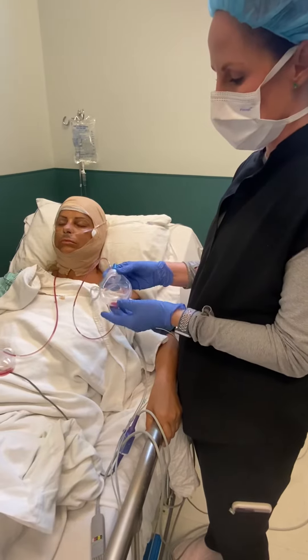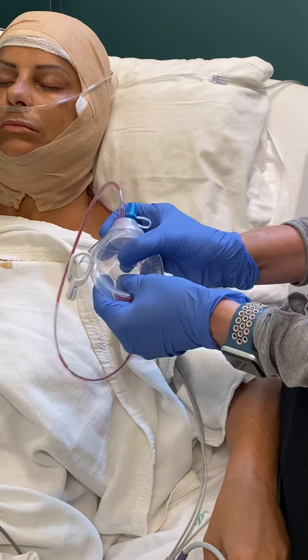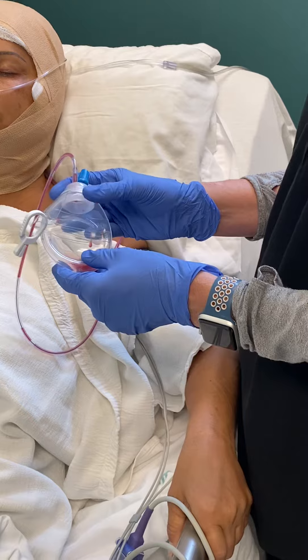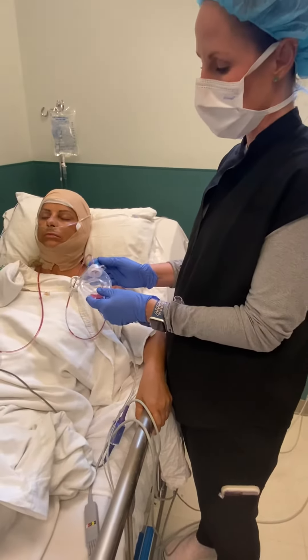Sometimes there will be a little leak in the system and the bulb doesn't go back down or suction down as well. That's not an emergency, but we do want you to call our office if that should happen, so we can get you in and see what we can do about that.